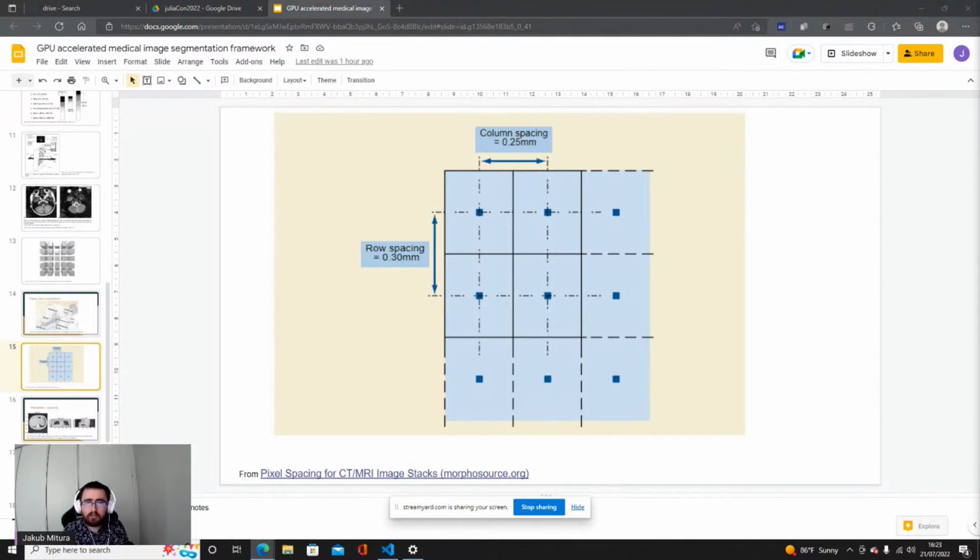Okay, a question: when custom formats like HDF5 and DICOM are needed, why not use ordinary file systems and folders? Basically, HDF5 is something not so commonly used. It's something that I have implemented here and proven to be fast. Usually, data in a clinical setting is in DICOM. DICOM is a standardization of data storage, and in nearly all hospitals, or maybe even all hospitals, the data is in DICOM. The other formats, like NIfTI, HDF5, and others, are usually for scientific purposes.